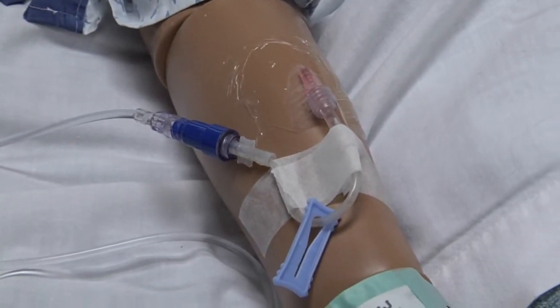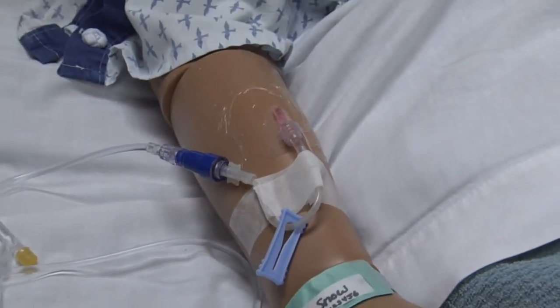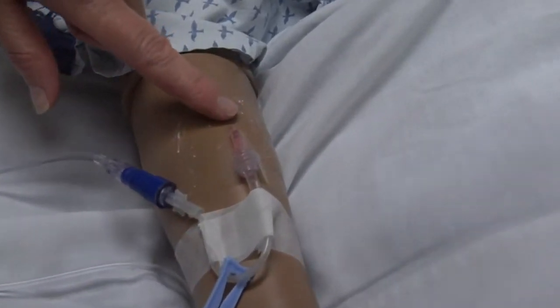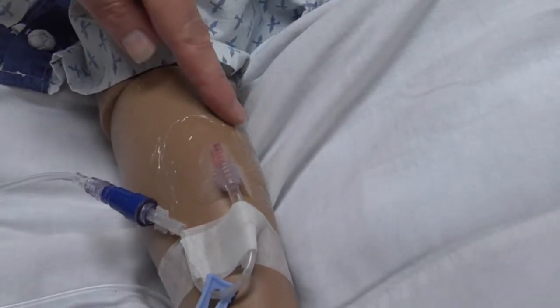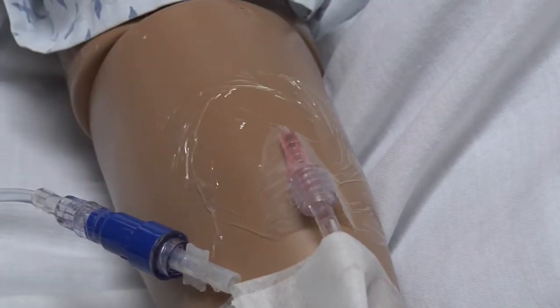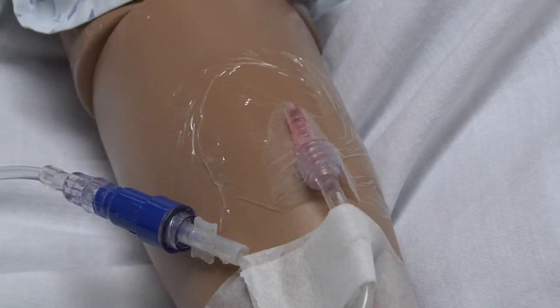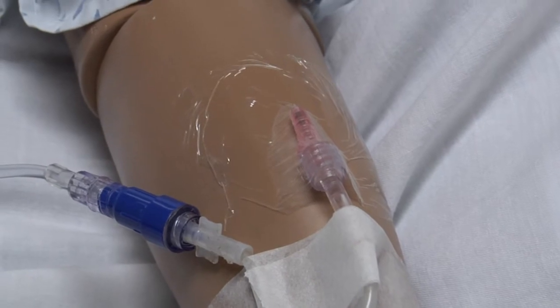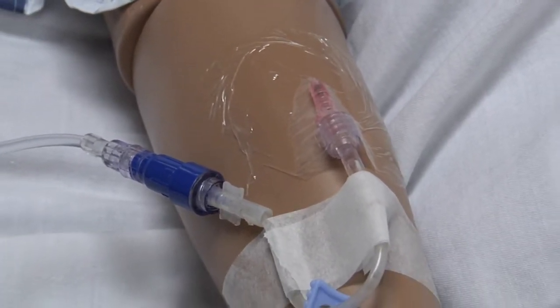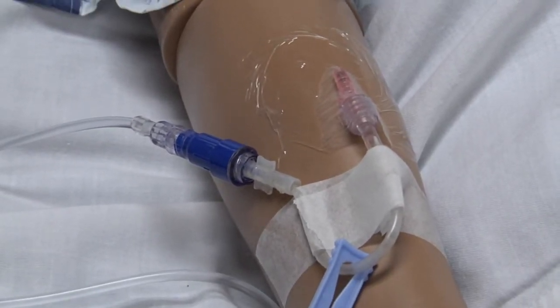If there was tenderness, it could be an inflammation that is starting. If that was the case, you would see redness right here at the IV site, and it would be, like I said, tender around there, and it might even feel warm to the touch. If that was the case, then I would remove this IV and restart it in a different site. Another problem that can come with the IV site itself is that it can be infiltrated. If the IV is infiltrated, that means it's no longer running into the vein.